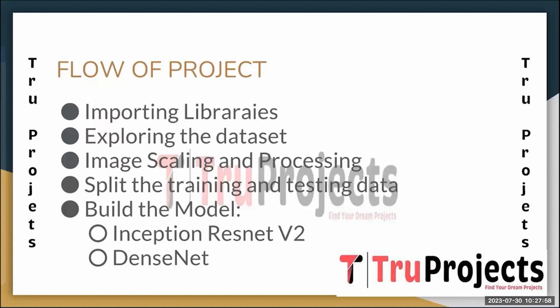DenseNet can effectively learn from smaller datasets, making it suitable for medical image analysis tasks like neovascularization detection. Its ability to alleviate the vanishing gradient problem and improve the gradient flow facilitates faster convergence during training. In this project, we explore the DenseNet performance, particularly in scenarios with limited data.